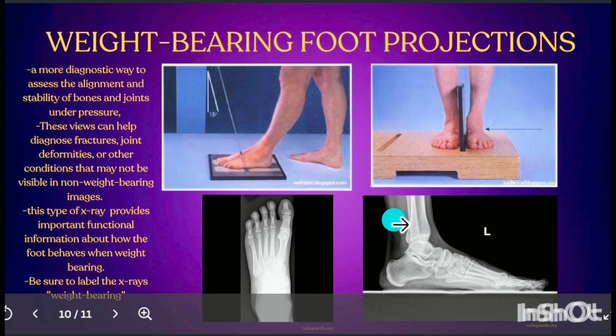You want to see, again, just like you would on a regular foot x-ray, the lower 1/3 of the distal tibia and fibula bones, and all of the foot anatomy in profile. Make sure it's not rotated in any way, that you've included the soft tissue, and that you have labeled this as weight bearing. Always check the plantar alignment before exposure. Small adjustments make major differences.